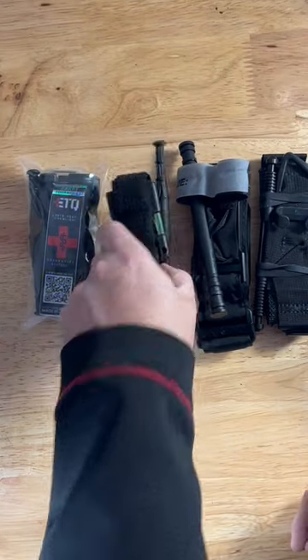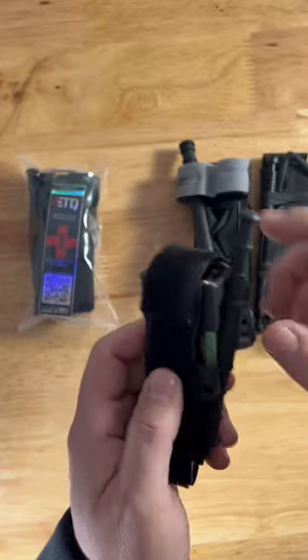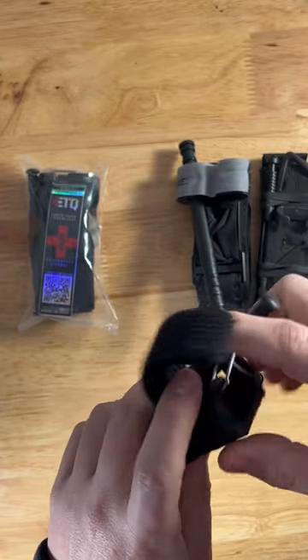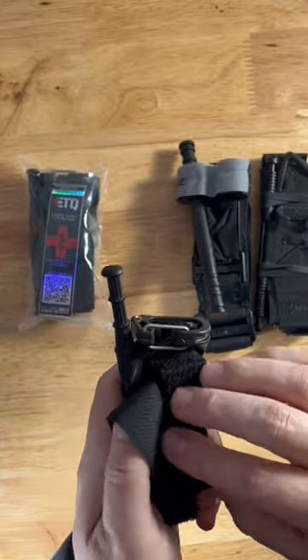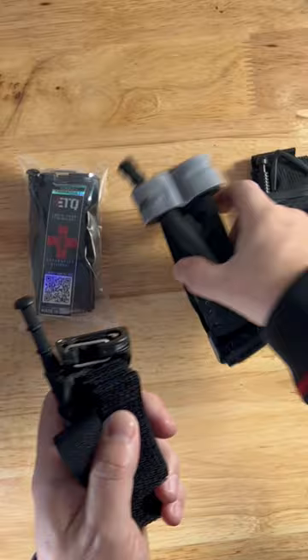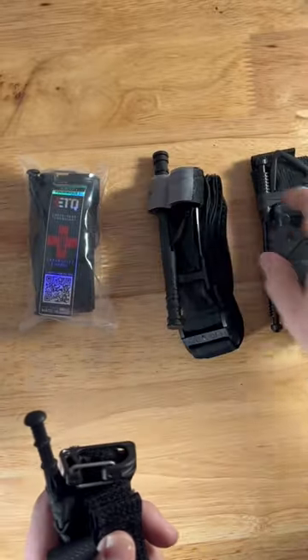Some quick features of the Snake Staff Tourniquet. It's got a chem light, so easily identifiable to emergency responders. I've got mine staged currently, but you can see they do have a metal gate here for the windlass to sit in, versus plastic or Velcro on the CAT 7, which has been known to fail.